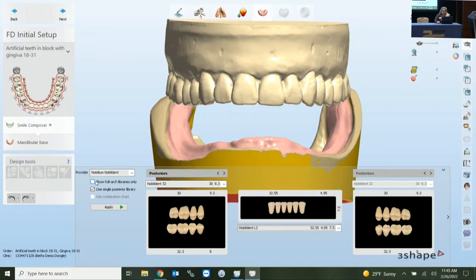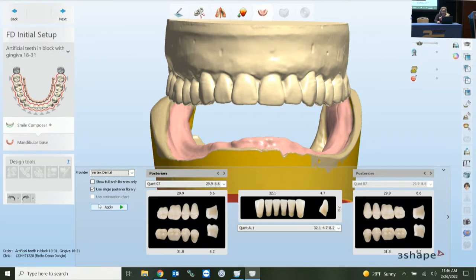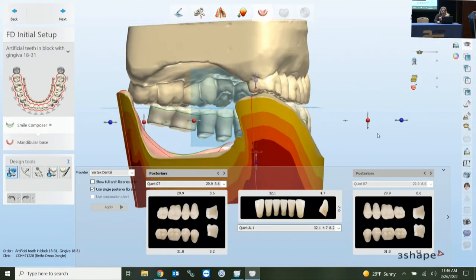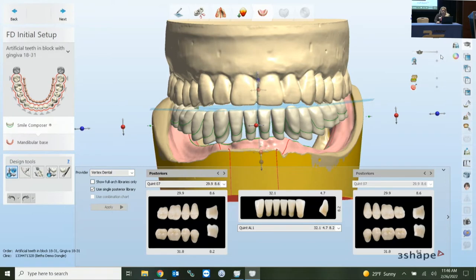You also have the option to only show full arch libraries, and the option to use a single posterior for both sides of the arch or individual selections. Individual is important when you're dealing with single teeth or bridged teeth depending on your library choices. We'll go back to Vertex, put something in there, click Apply, and then evaluate the library to see what you like initially.